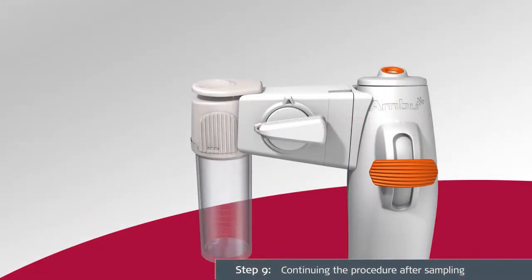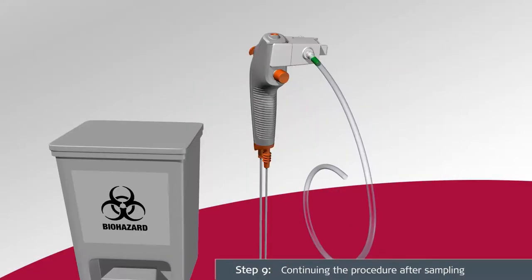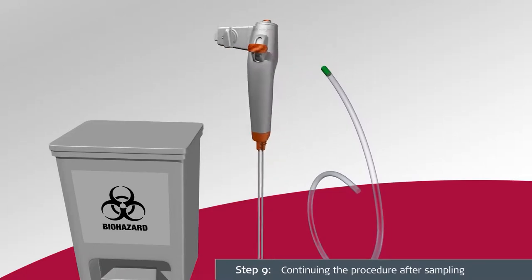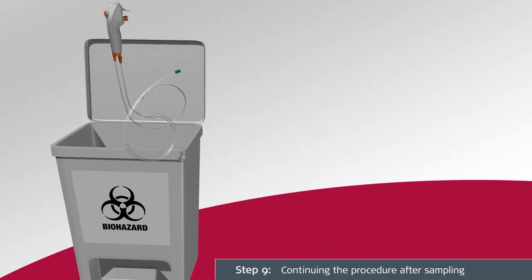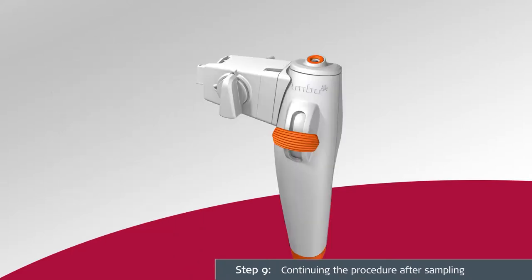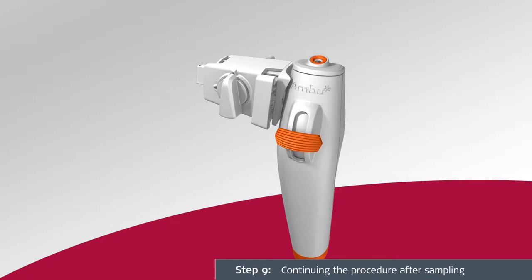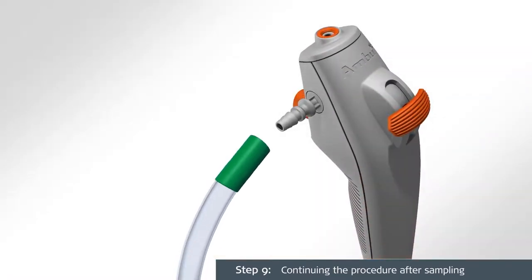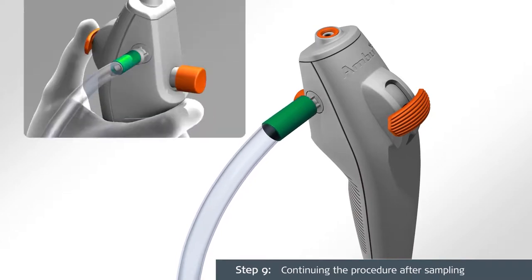Once the sampling procedure is complete, disengage the suction by pulling the suction tube off of the sampler bridge and discard the sampler bridge along with the A-Scope IV Bronco. If you need to continue the bronchoscopy procedure after sampling, disengage the attachment lock to detach the sampler bridge from the A-Scope IV Bronco, then pull to disconnect. Reattach the suction tube to the suction connector on the A-Scope IV Bronco and continue.